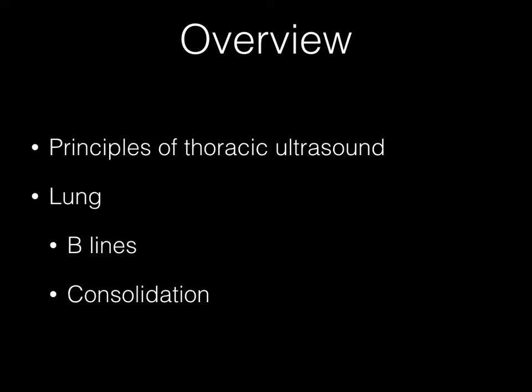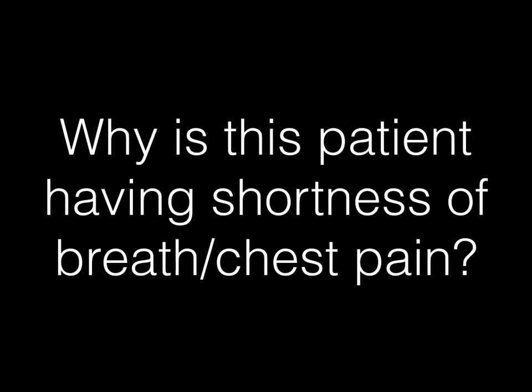Now, there are 1,001 things you could look for, but let's just simplify it down into B-lines and consolidation. And the reason we look for this is when we're asking ourselves the question, well, why is this patient having shortness of breath or chest pain in the first place?